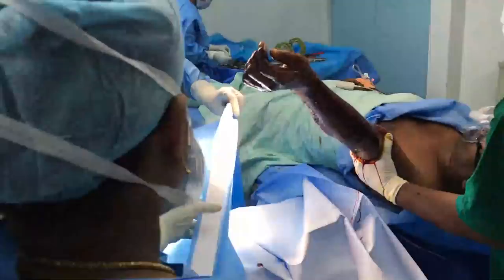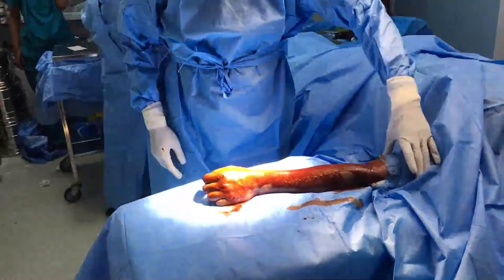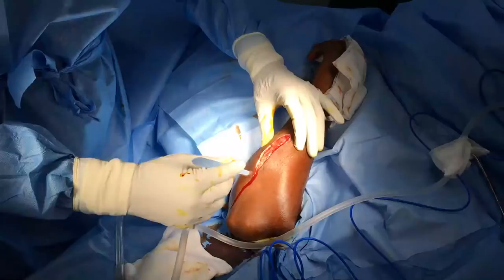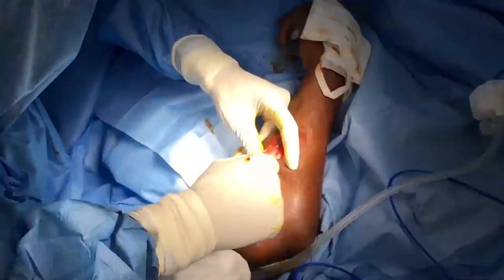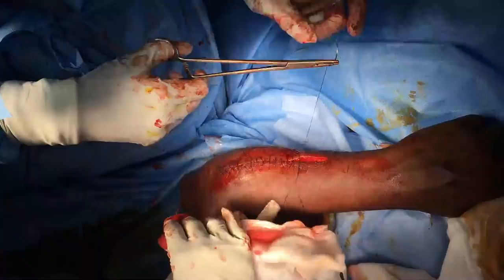We can appreciate the infected ulna on this patient. Through a subcutaneous ulnar incision, the plate is identified. The screws are removed and the plate is extracted.